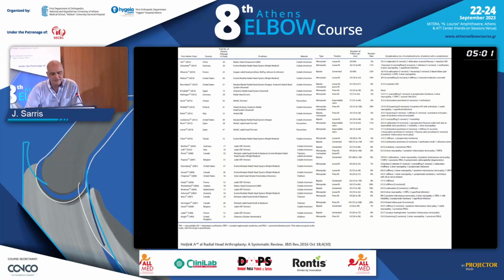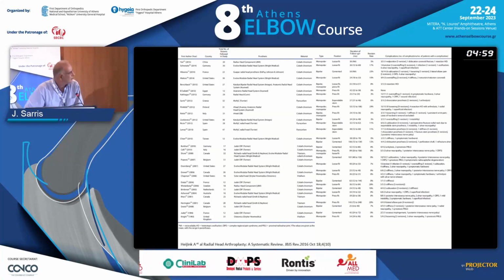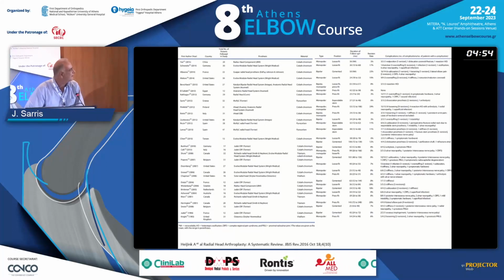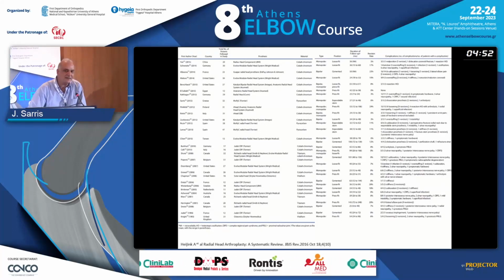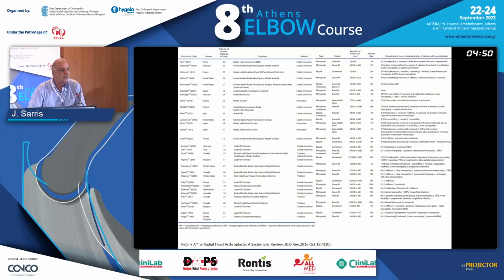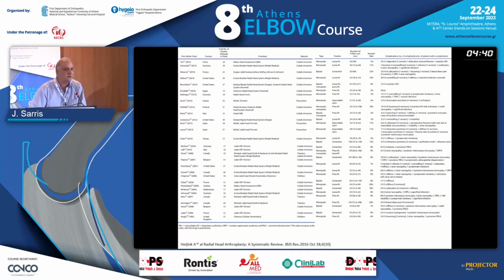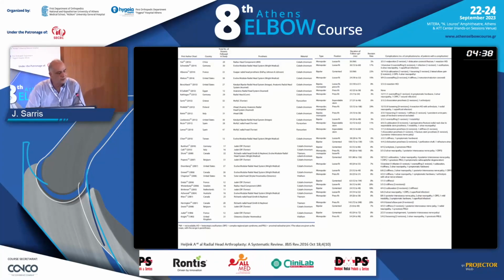But at the end, trust me, we can see, but it's a very thick slide. We can see that press fit has, in some papers, 0 revision rates, and in some papers it has 29%. The same happens with the loose fit. It can have, in some series, 0%, and in others, 28%.